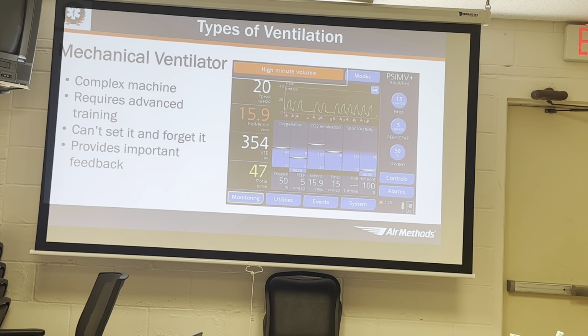Sometimes you'll get a patient on a ventilator and it seems like it's forever before anybody's doing another ABG or reassessing to see if that's adequate. Maybe your respiratory therapist is in with another patient and now it's been 2 hours and there have been no vent adjustments. Your patient's sitting at 100%. Their sedation or paralytics have worn off, and now they're bucking the vent every 5 minutes.